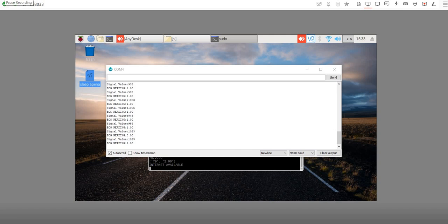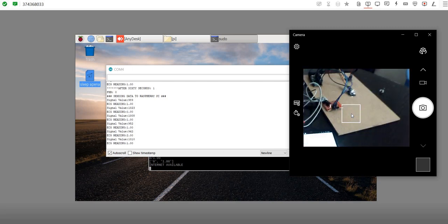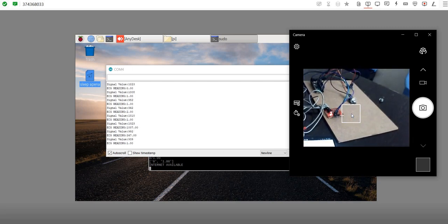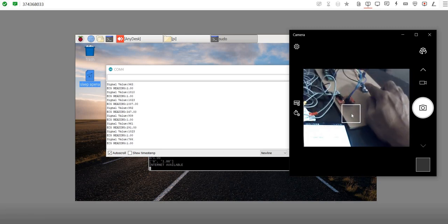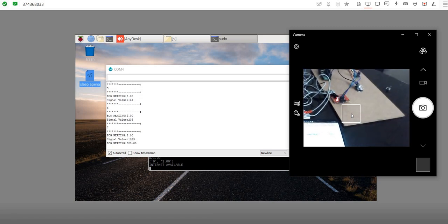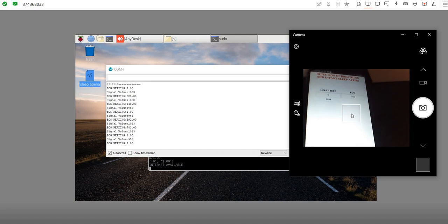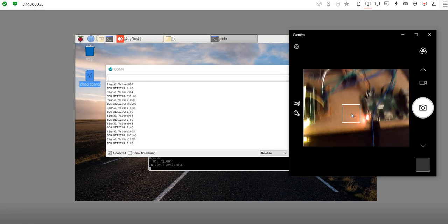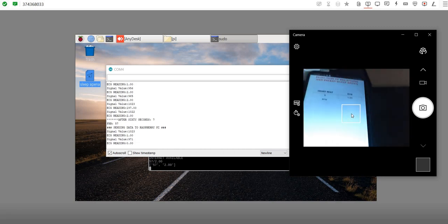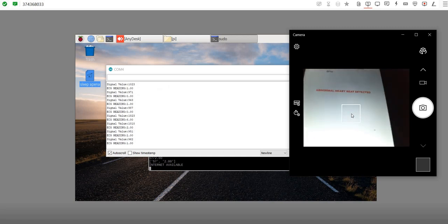So now I'm showing the heartbeat calculation using our code also. Now you can see this is the Arduino Raspberry Pi program. It is calculating the ECG value. So whenever I keep my finger on the particular LED, it starts to calculate our heartbeat, like pulse counts. Whenever I remove it, the pulse count is stopped, and for every 30 seconds the data will be transmitted to the Raspberry Pi section. So this Raspberry Pi section will update the data to the alert, and the data will be transmitted to the Android app also. So the app also gives you the alert like abnormal heartbeat detected.